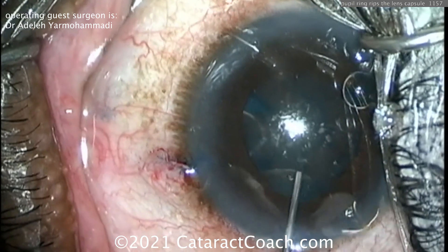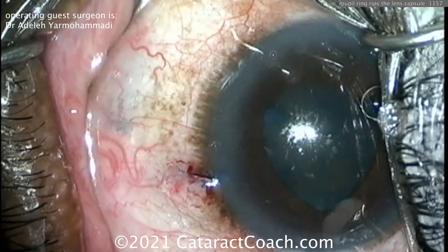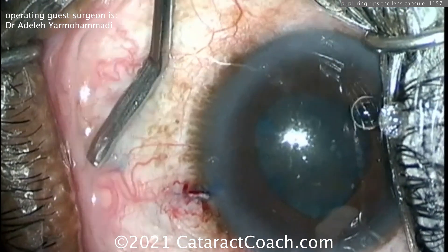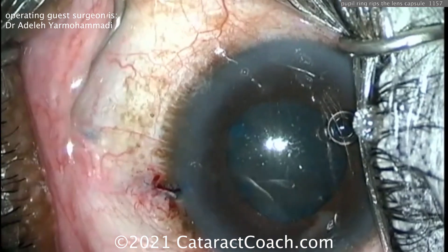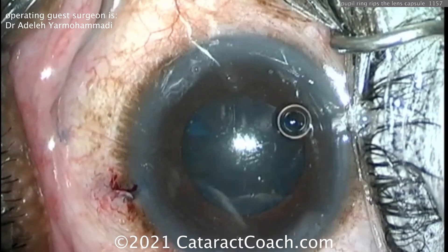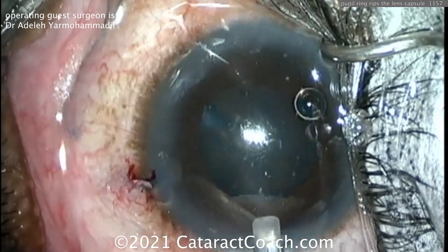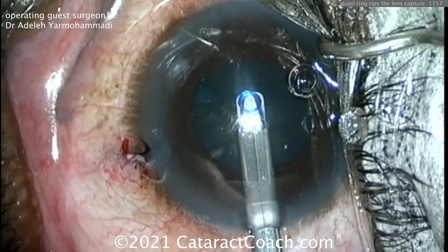This is why I encourage you to submit your videos. The capsule has been stained with trypan blue dye. Viscoelastic is being placed inside the eye, lifting up the iris a little bit in preparation for placement of a Malyugin ring. There's a lot of oil in the tear film — not the best draping — but watch carefully: here comes the Malyugin ring.